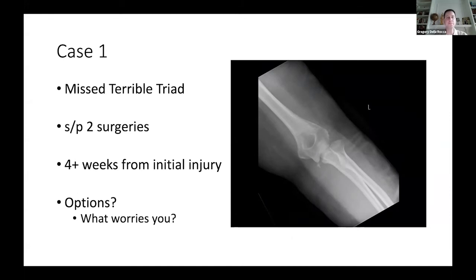And so I may make some type of a champion's try, or maybe an amateur's try, at fixing the ligament if I can. But I'm almost always going to turn to some type of an augmentation, whether it's either autograft or allograft tendon, or some type of an internal brace.